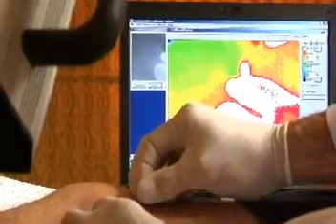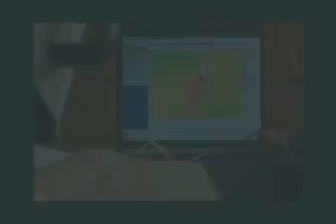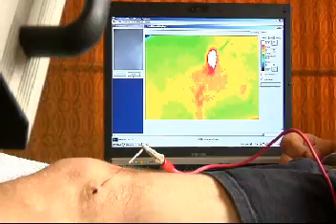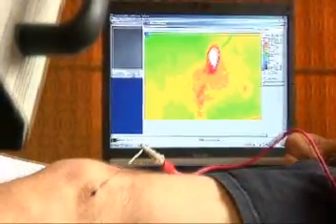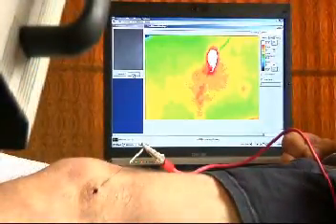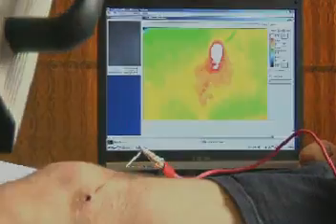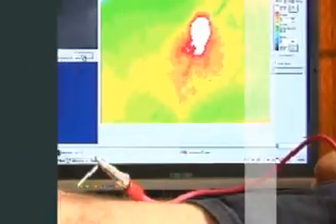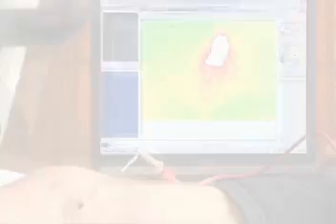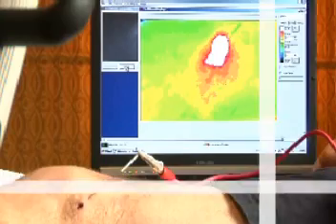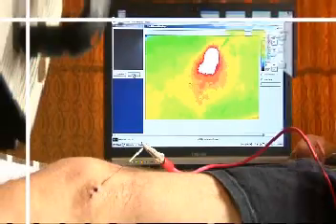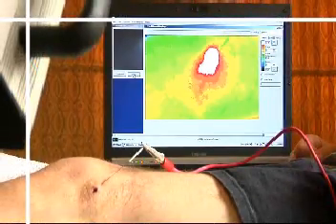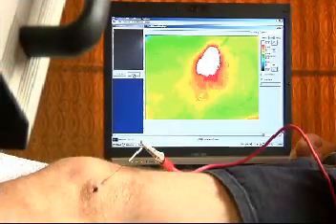Try to use the same hole if we can. Right on the edge maybe I can feel it but I can tolerate it. It's starting to get a little more intense. We're just about done.